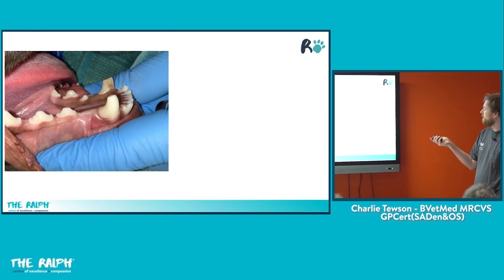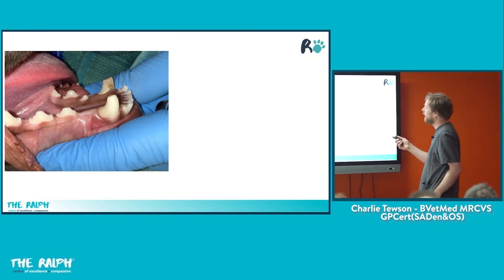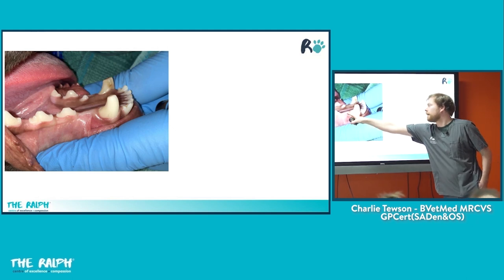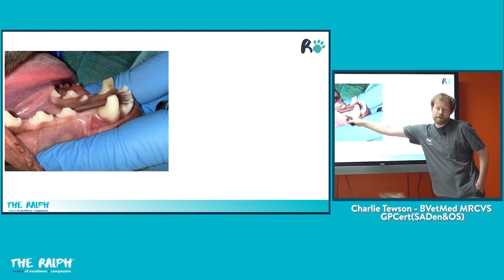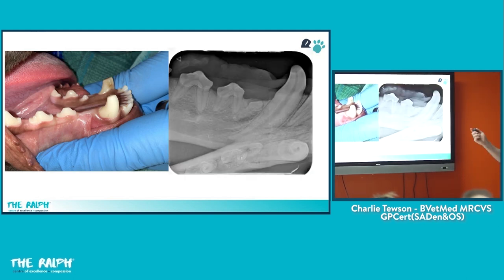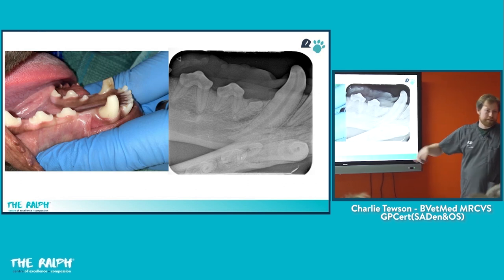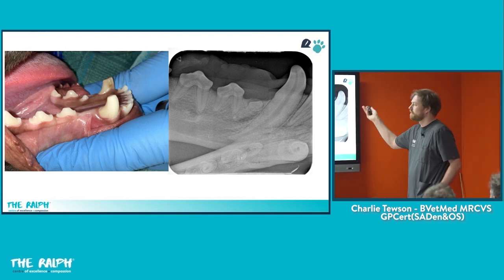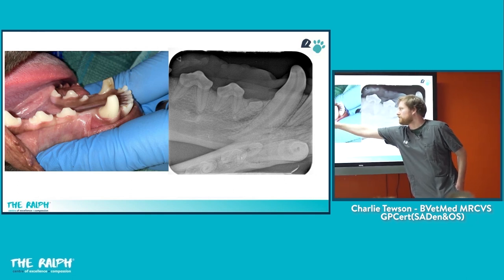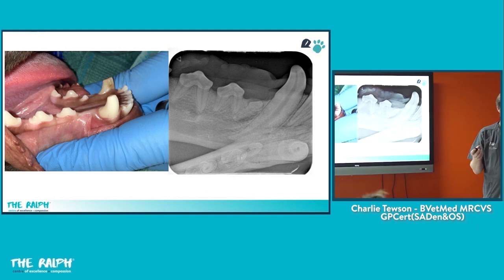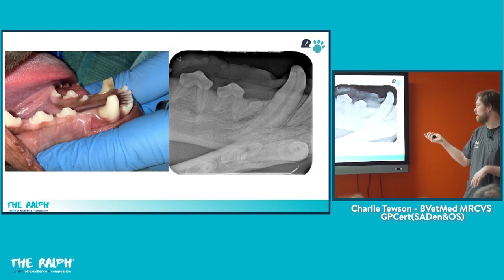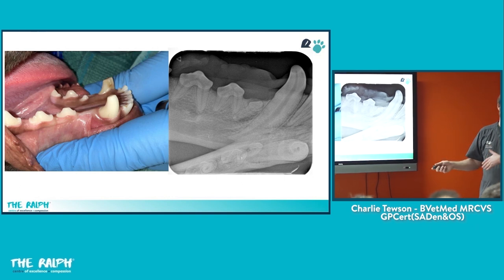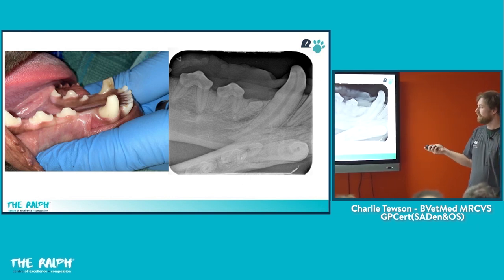Here's a good example I added last minute — a case we had last week. We saw this case because it had a broken left mandibular canine and was in for a root canal. Just as an incidental finding, we spotted a missing first premolar and could see it weirdly erupting on the other side. We took an x-ray and found a little tooth hiding. This happens all the time — the more x-rays you take, the more underlying pathology you'll find. Because it's so subtle, if you're just doing a routine check you're not specifically counting teeth, it would certainly have been overlooked. This tooth will be really prone to forming a dentigerous cyst causing big problems later, so better to know about it now and treat it while it's relatively easy.